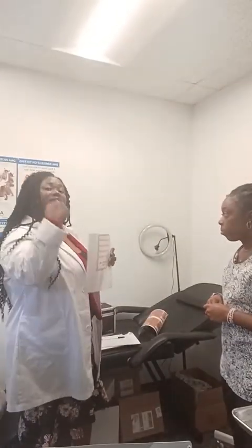So I have this sign up. You can make something similar for yourself. Show the donor, restate it, and she only has 4 minutes. So she's gonna go ahead and pee. Thank you. All right, while I'm waiting, I'm making sure I have everything. I'm cross-checking the details on the CCF forms, making sure everything is good.